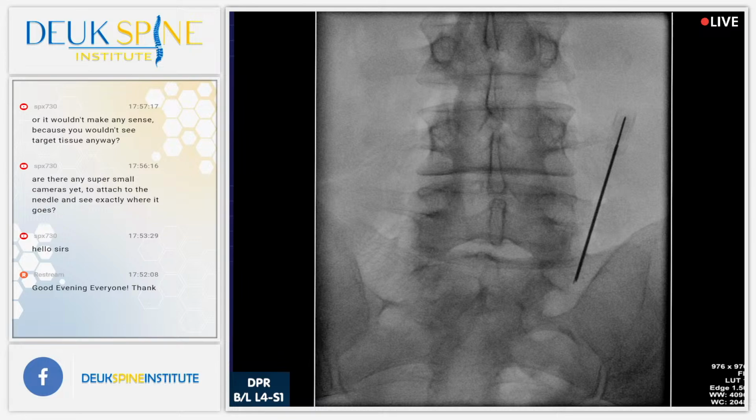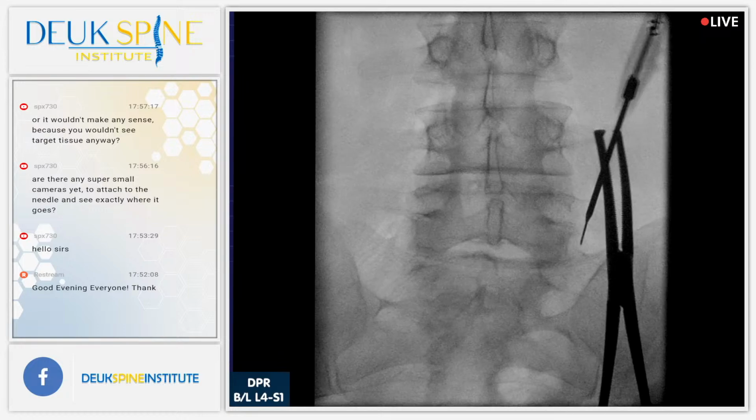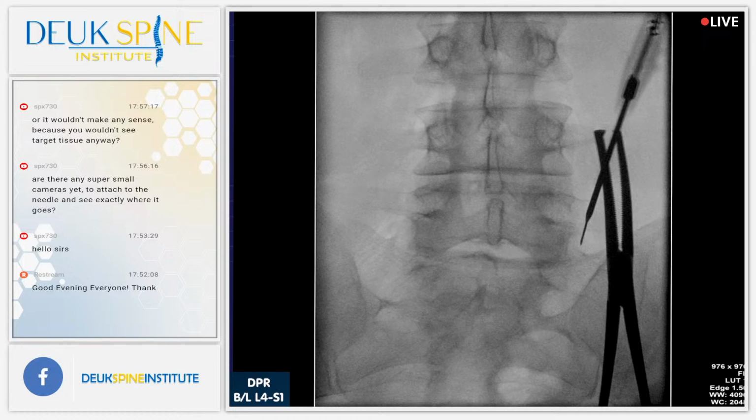With an RFA, the doctor just plants the probe. See, that's the perfect spot right there. See the tip? That's exactly where you want to be. I mean, literally perfect. The nice thing about this patient is he has really nice anatomy. He's got a nice physique, so there's not a lot of fat or deepness we have to get to. It's pretty straightforward.